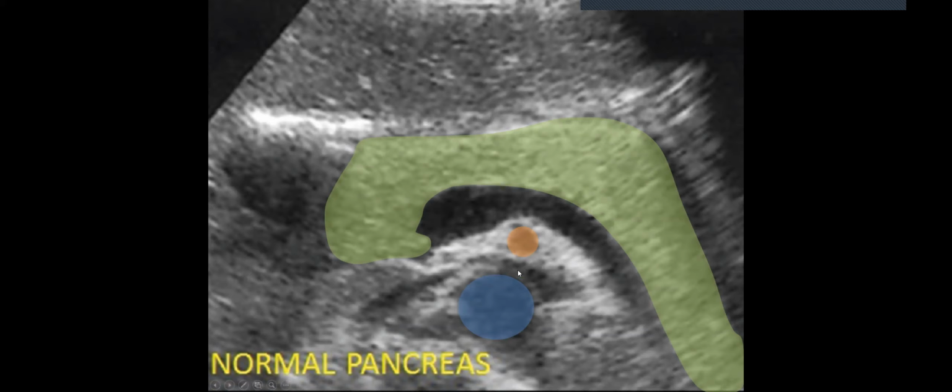And notice the surrounding echogenicity. Oh, and there's, yeah, that's it. Oh, I'm seeing it on my other screen. Freaking me out. Kind of a compressed IVC over here, but then the left renal vein traveling from the kidney all the way up over, going across. So that's what that is there.